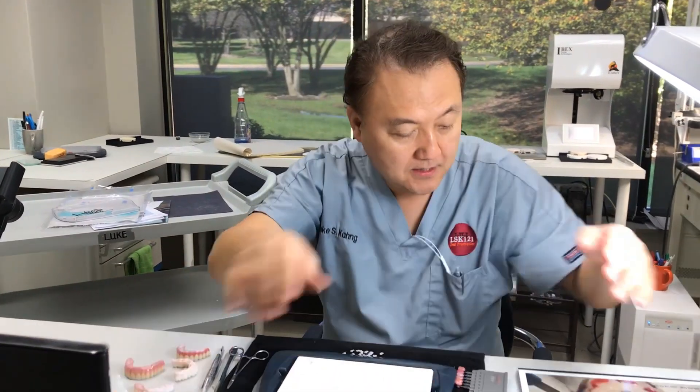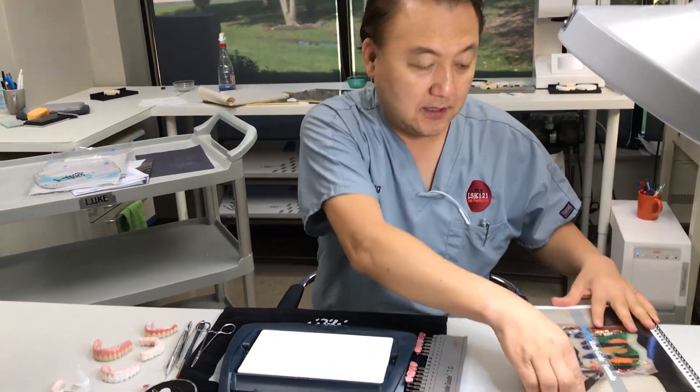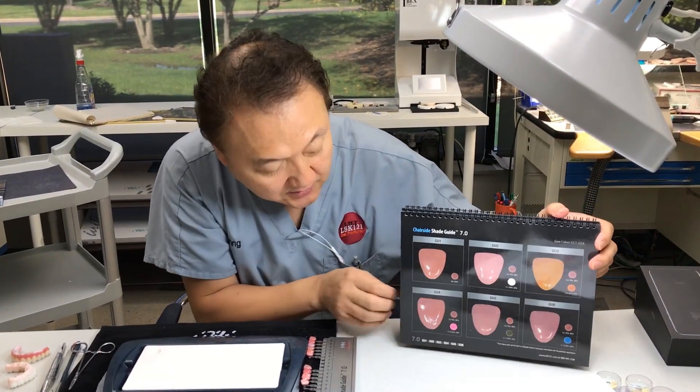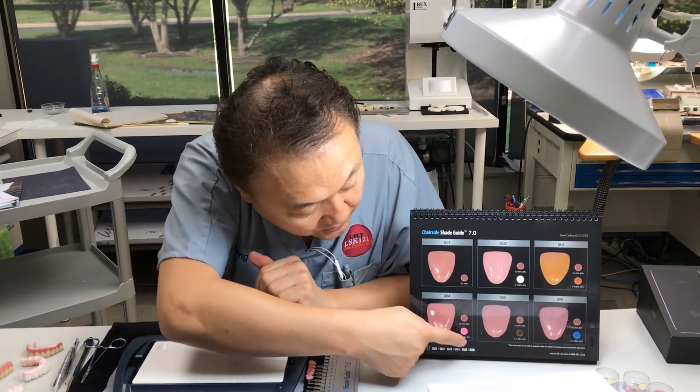So this is a book, and here's my formula book. I can go all the way back and get the information. I'm using the regular pink, but I also need some stain mixed together.